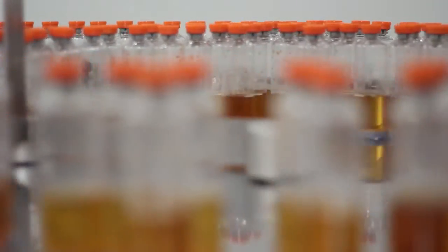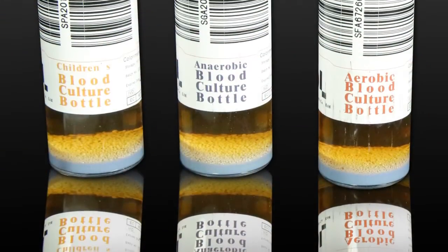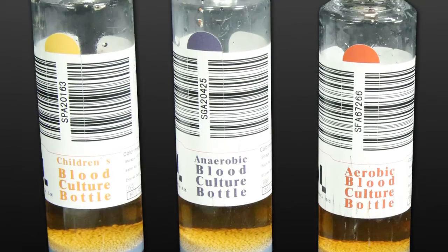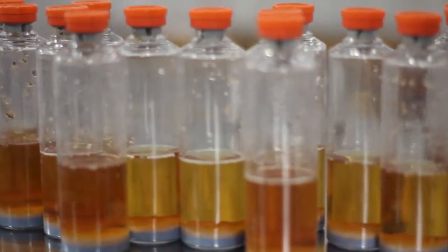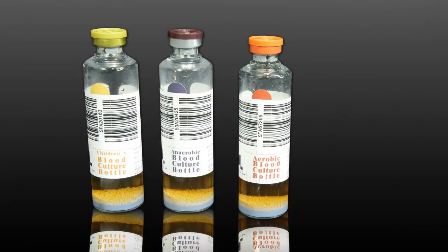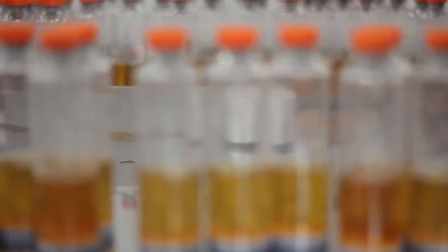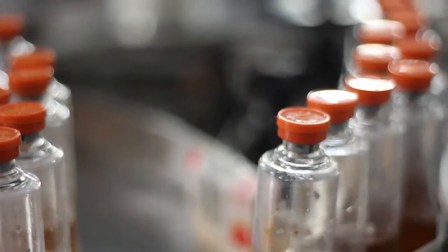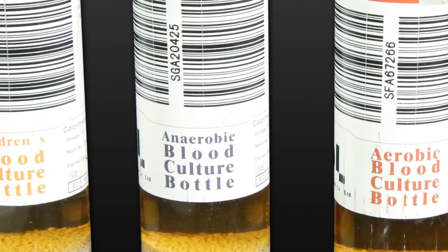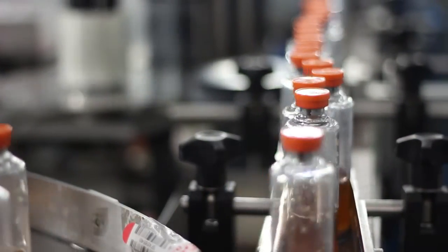Blood culture bottles are for single use. Note the date before use and make sure to use within the validity date. Please read the instructions before using. If turbidity, sedimentation, or discoloration appears in the bottles, please stop use. The blood culture bottle is negative pressure and can use a sterility blood collection tube to collect specimen. Please pay special attention to specimen collection and bottle disinfection, avoiding false positives caused by bacterial contamination. The inoculated bottle must be put in the incubation box within 2 hours.